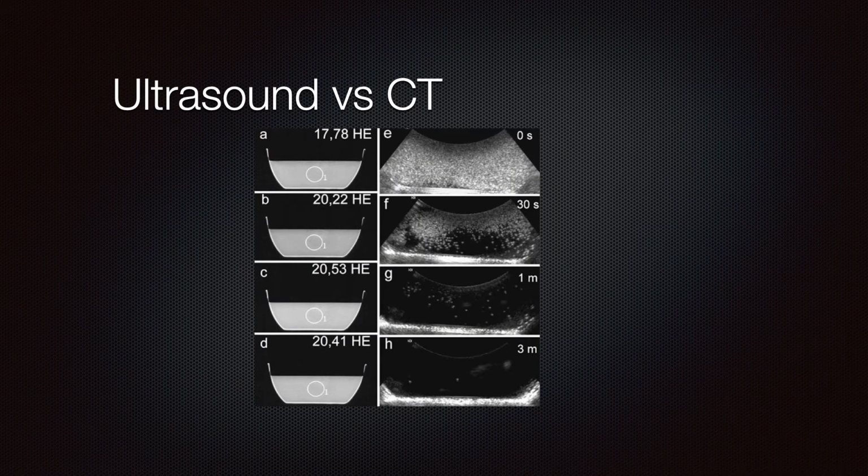Another important thing to understand about ultrasound is it's much more sensitive to see subtle differences in fluid. And here is a bucket of water that was agitated, and immediately after agitation it was ultrasounded at 0 and 30 seconds, 1 minute, and 3 minutes. And then it was also CT'd exactly at the same time.